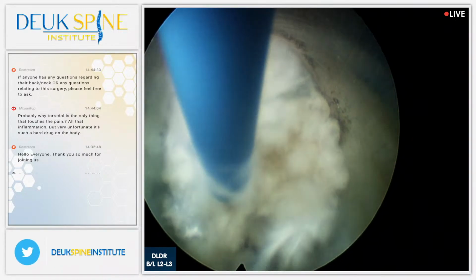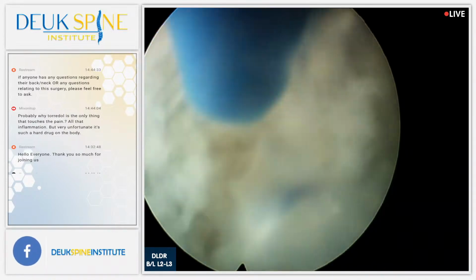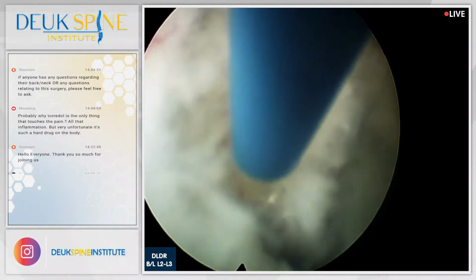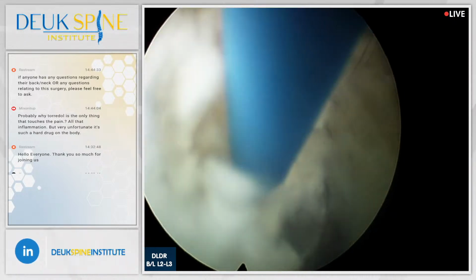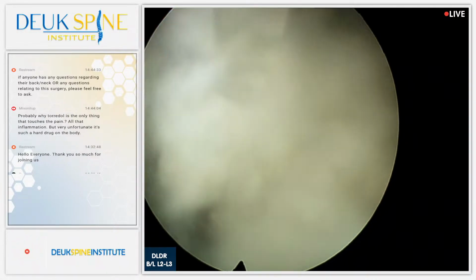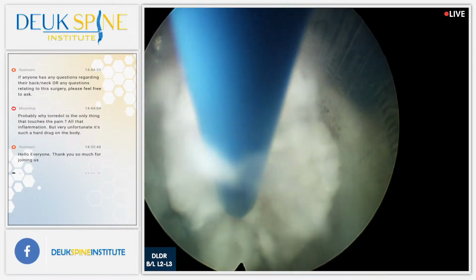The nice thing about this surgery is I can see the disc herniation and I can pretty much age it, tell you how old it is. Now, reality is that most of these herniations are different ages, right? So there's an initial injury at maybe 5 years old. Then there's another injury that happens at maybe a couple of months old. So I can actually see all the different ages of all the different injuries because I'm looking right at the disc. And I understand the pathophysiology of repair with the inflammatory system.